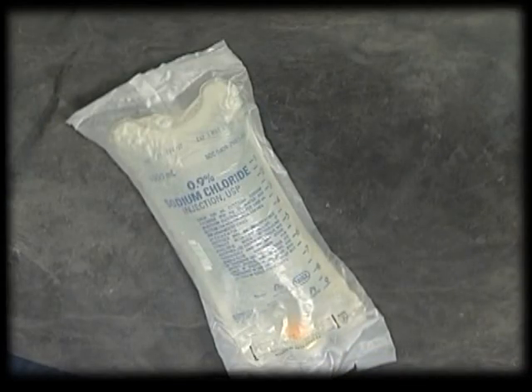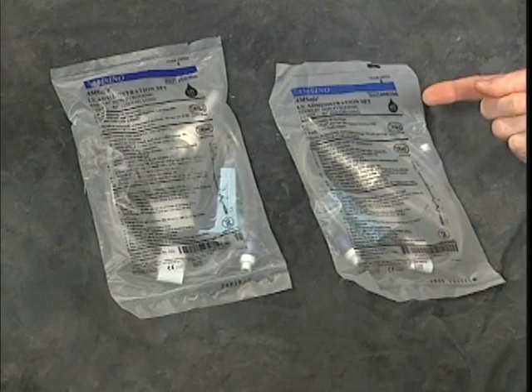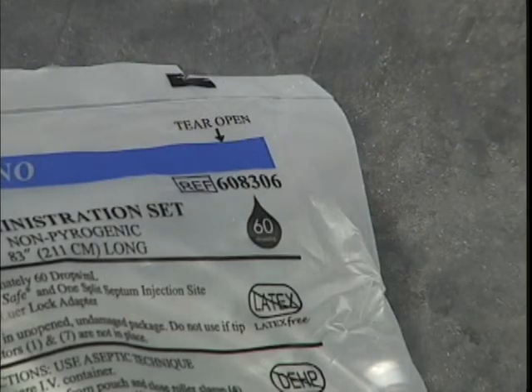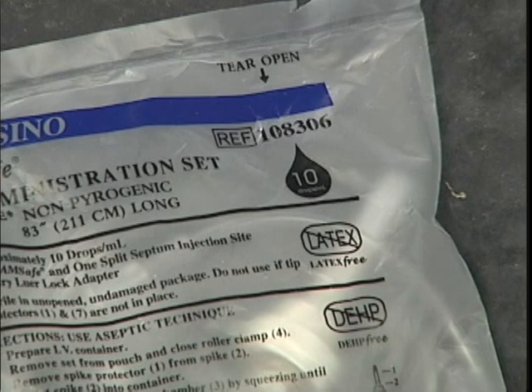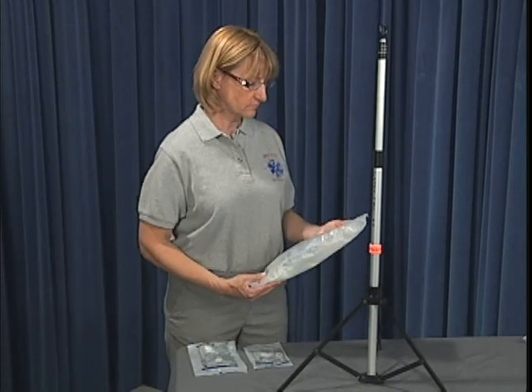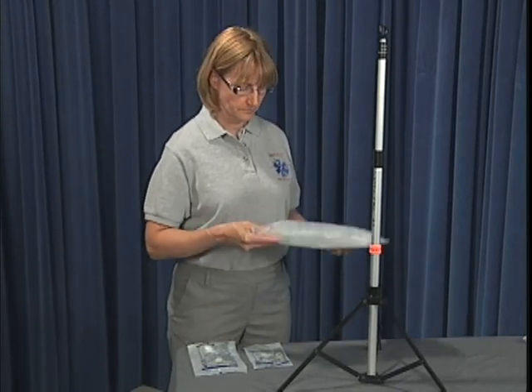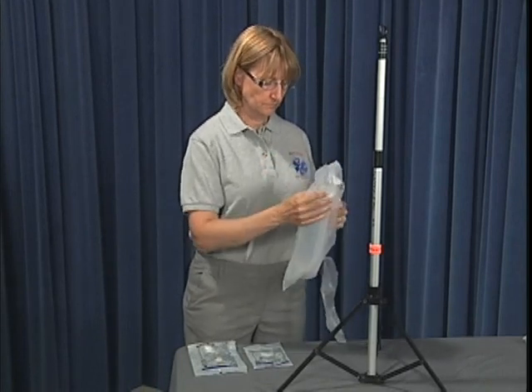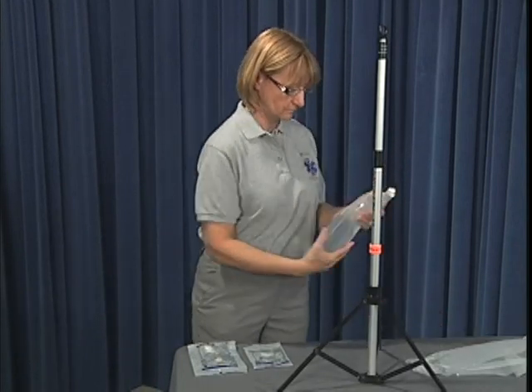Select the appropriate IV solution, double-checking the expiration date, color, and clarity. Administration sets generally come in two sizes: 60 and 10 drop sets. The appropriate size is determined by your protocols and the patient's medical condition. To open your solution, tear the outer packaging at the pre-cut slit on either end of the bag, then recheck the clarity of the solution and expiration date.